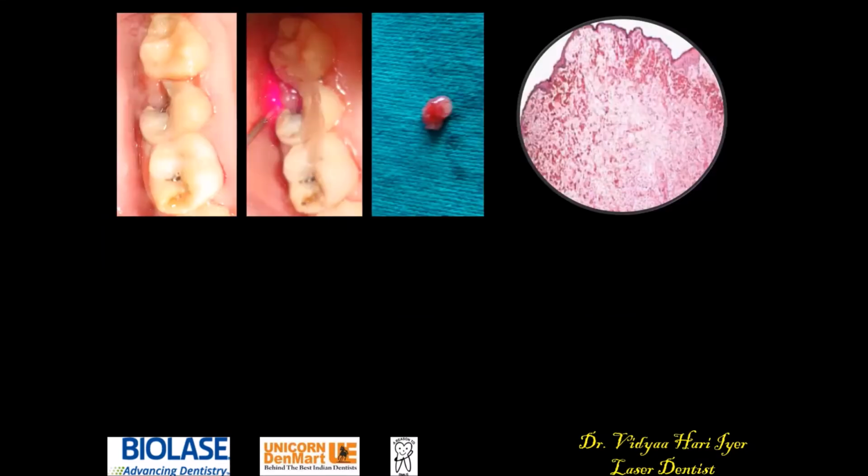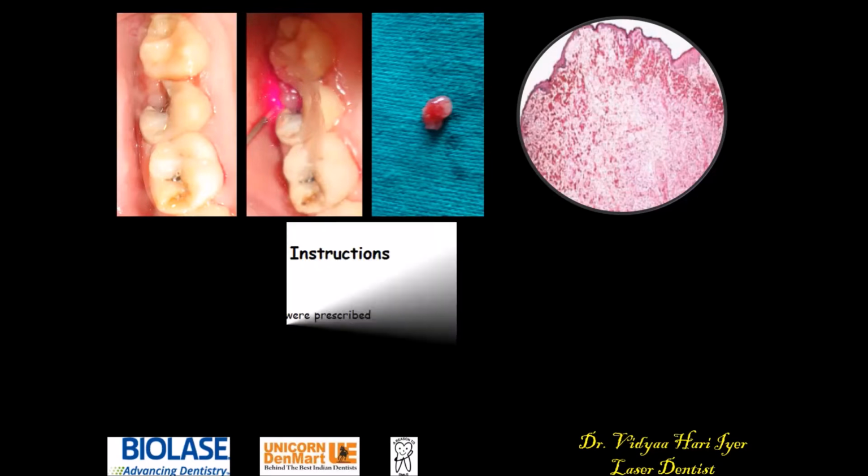So here is another patient where, especially when we are trying to do, say, root canal procedures, there might be an extension of the tissue either from the gums or from the tooth itself, which grows in that area. So with the laser, I can just remove that.